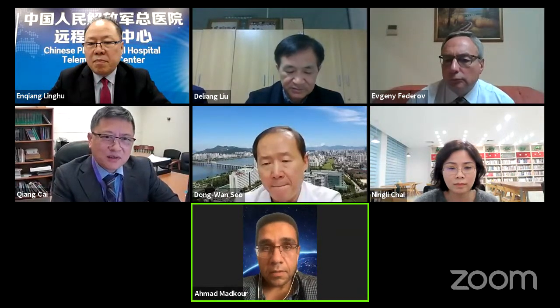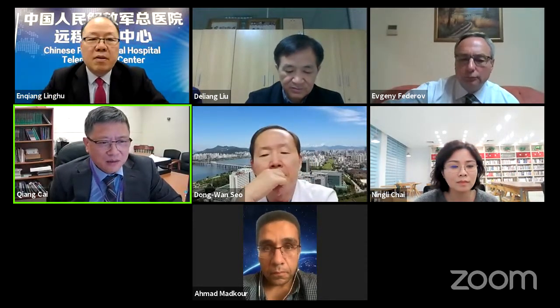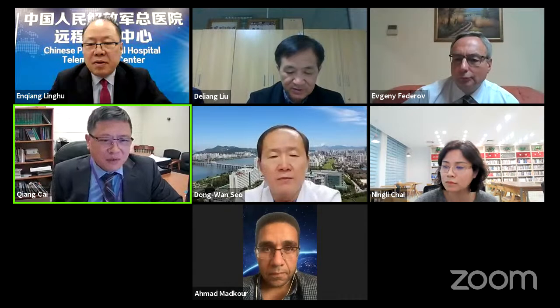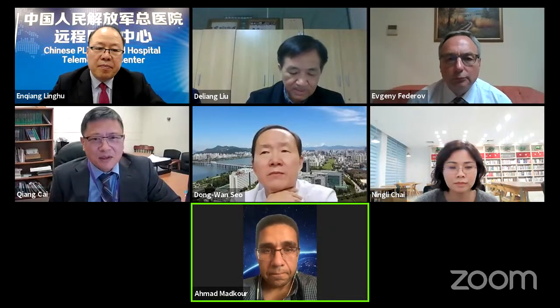Good question. That's a very good question. I think I can answer for Dr. Liu. Number one, it doesn't happen very often, and I don't know your experience. In my experience, I've done almost 1,000 of these, and DVT happened 0 times. Number two, if necessary, you can start anticoagulation, because bleeding inside the tunnel also doesn't happen very often. So I think if necessary, you can do it. I hope I answered your question. That's a very good question.